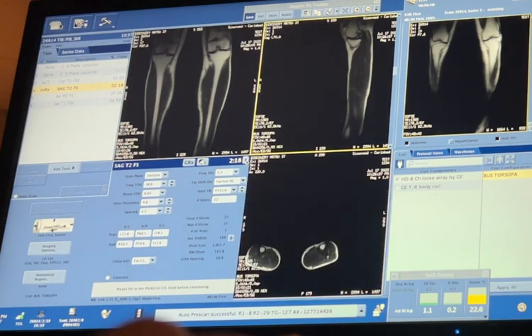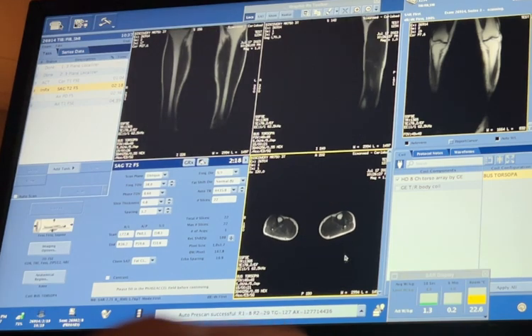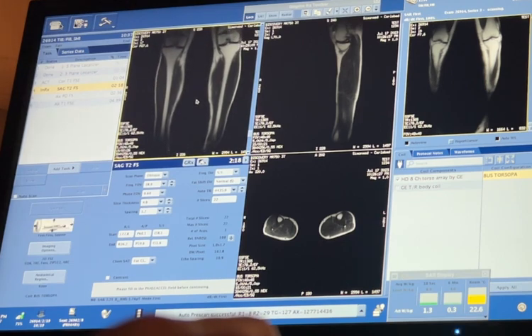Okay, so yeah, let's open that. Perfect. Okay, so let's right-click, hold, and move that up. There you go. Oh, this will be perfect. Unclick, update all those. There you go. Let's move those down. There you go. And then down to. Okay, so now we're doing sagittal.